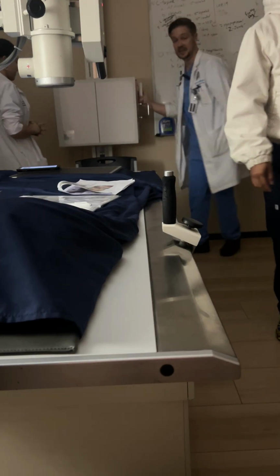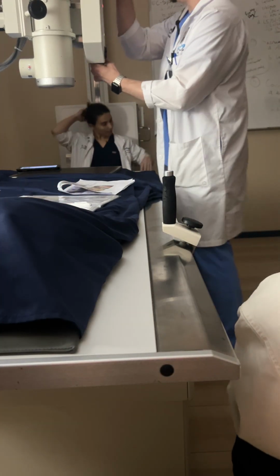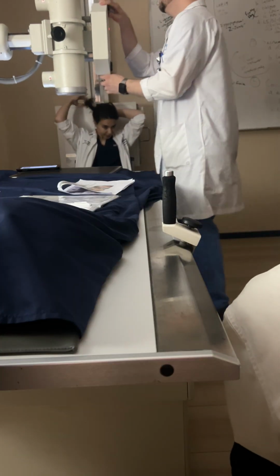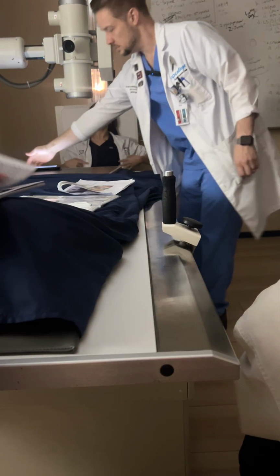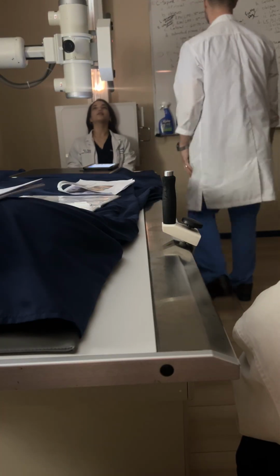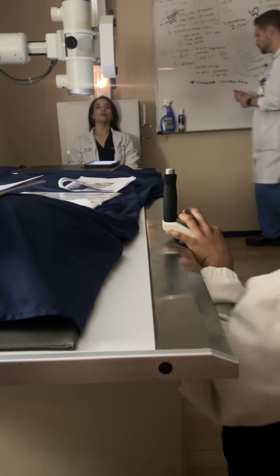by 12 in here lengthwise. Okay, make that in your notes. First thing we're going to do is called the AP axial Towne method. Take every clip out, every earring. I'm not even going to write it down.